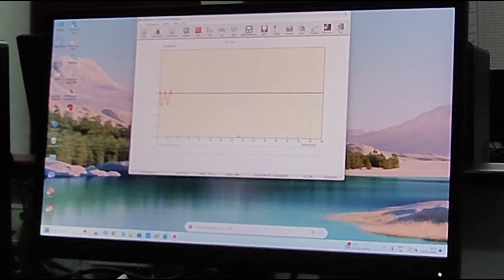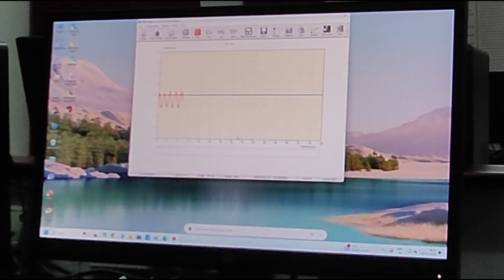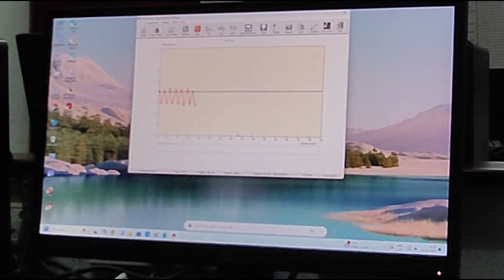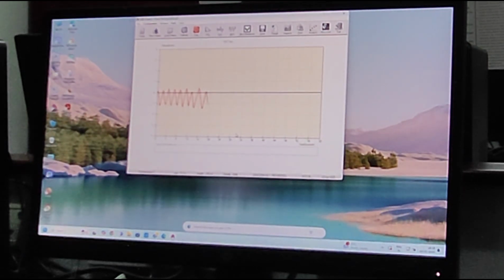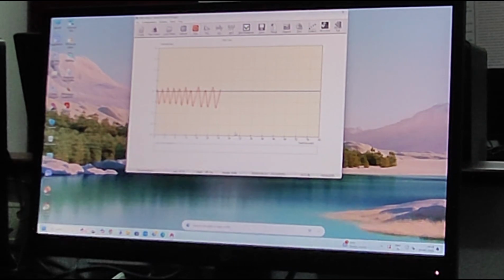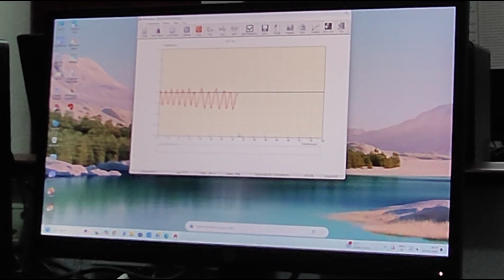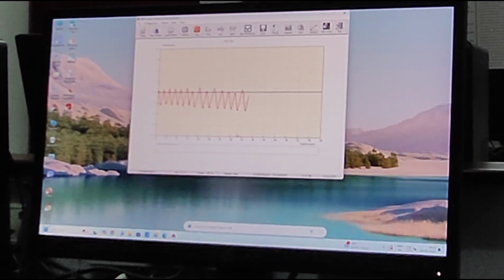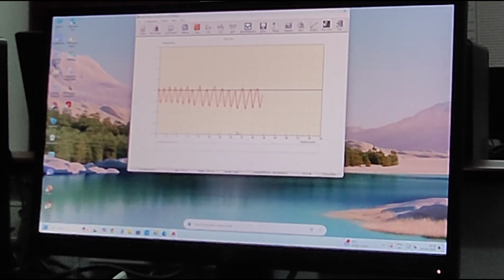During the test, the patient's input through the spirometer will be recorded as an electrical signal through the system application. During the test, the data will be monitored in the display, showing how the inputs are being recorded. Based on the recording, we can get the analysis and the results.